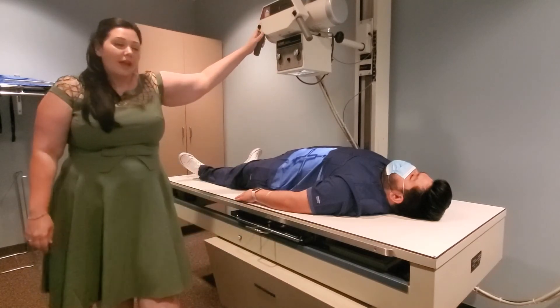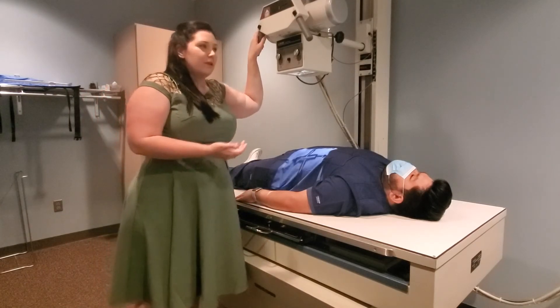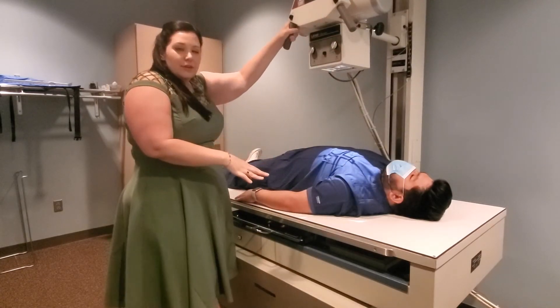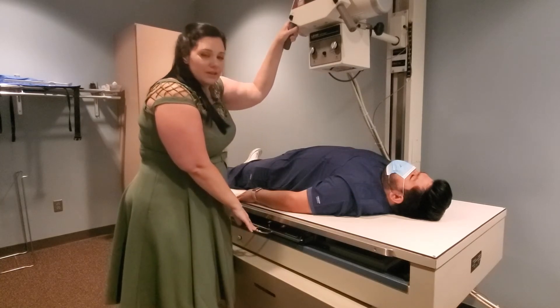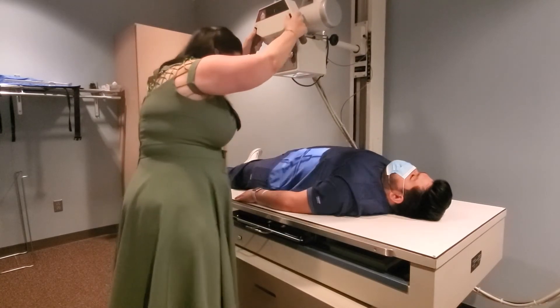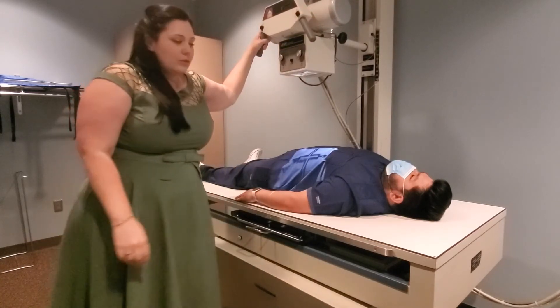If you get in the habit of moving the bucky, your chances of errors go up. If you move the bucky tray and forget to account for it, you won't get a picture of anything. Use your floating table top — it's your best friend in x-ray. Use it as often as you can to get the pictures you need.